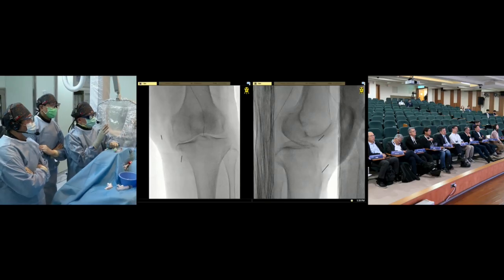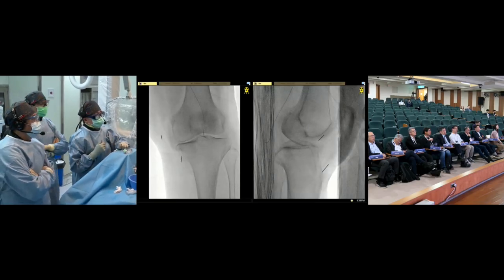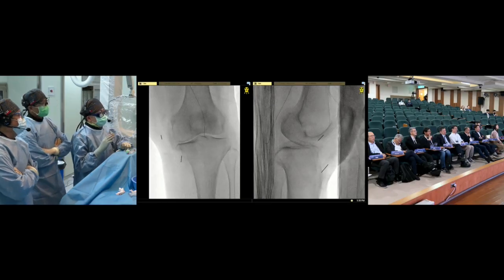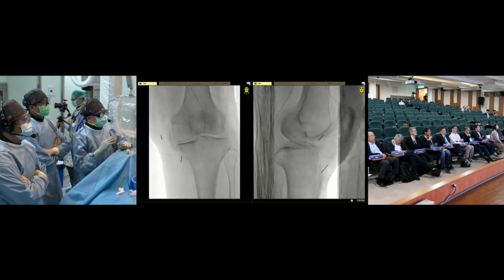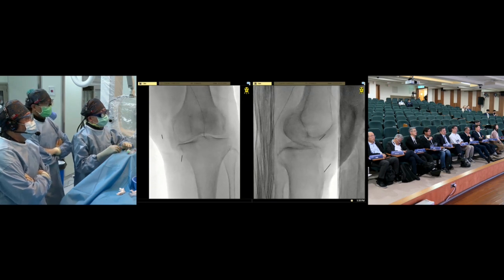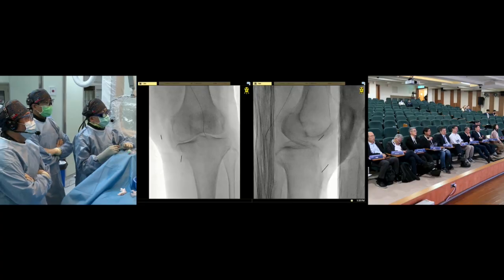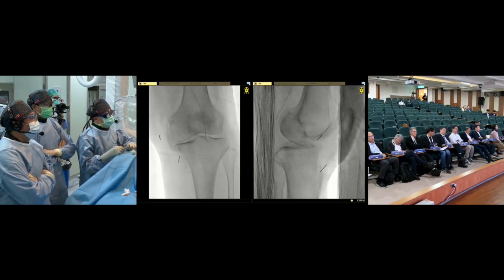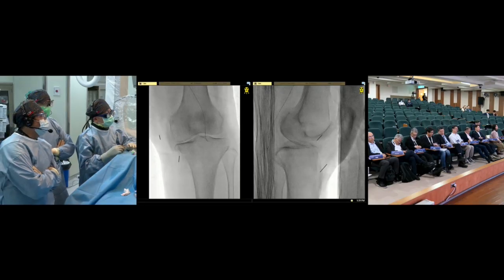I'm a cardiologist and Dr. Wang is the radiologist, but the principle to enter the vessel is the same. We make different shapes so we can feel the contour and takeoff of the vessel. It will enhance our success in entering side branches.